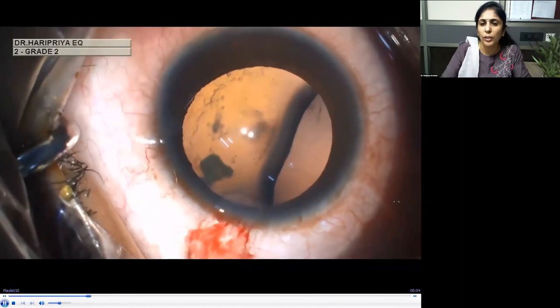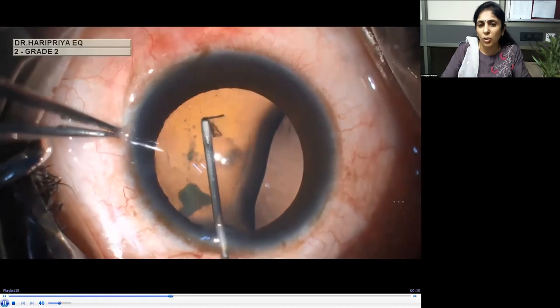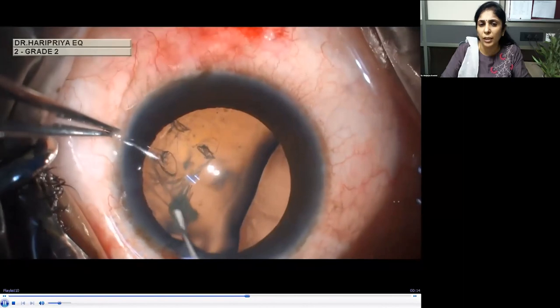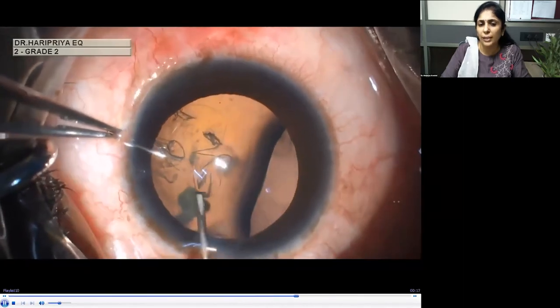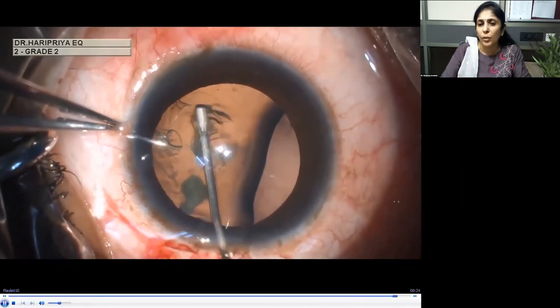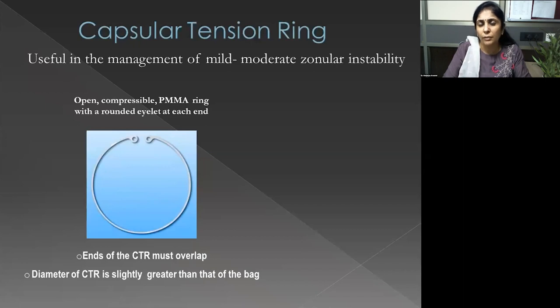When dealing with the rhexis, use a high molecular weight viscoelastic and start the rhexis away from the site of zonular dialysis. You have good counter-traction where zonules are intact, then move toward the site of subluxation — but make it smaller there because there's a high risk the rhexis might run away. Don't make it too large at that site, as we don't want a rhexis extension.